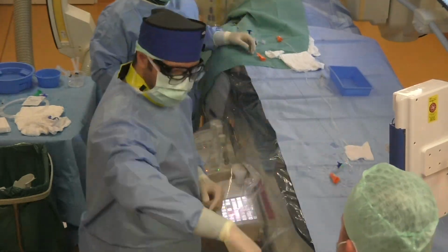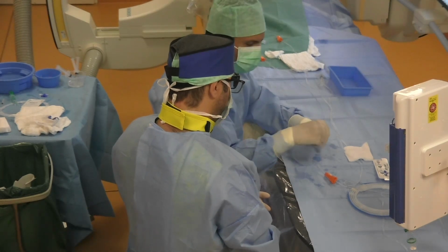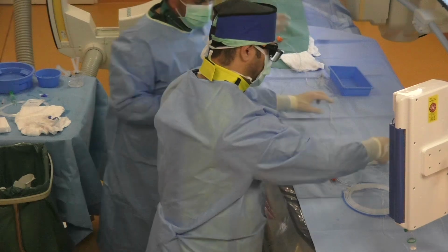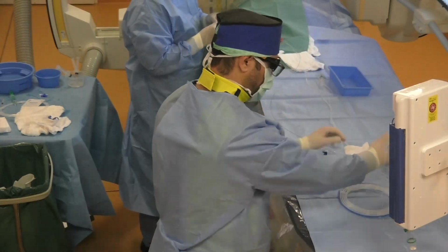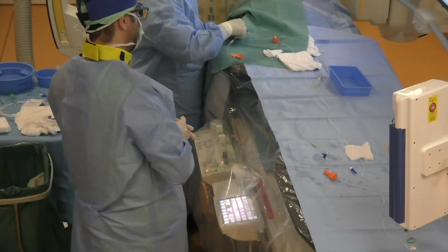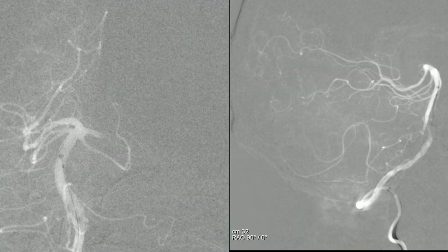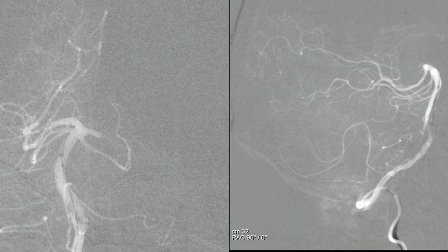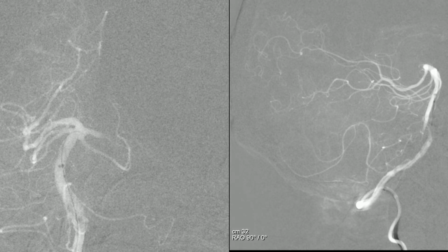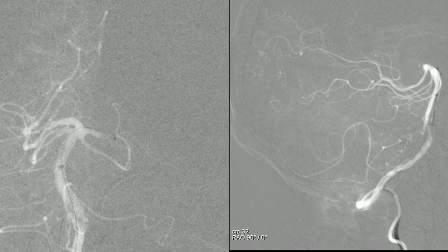and take the microcatheter Phenom 21 and the microwire Synchro Support Select 14. Insert it in the microcatheter, bring the torquer behind, and shape the tip of the microwire. And now we can push them both into the aspiration catheter and try to navigate the left PCA. We know it is a stenosis that has got occluded, so we should be careful.